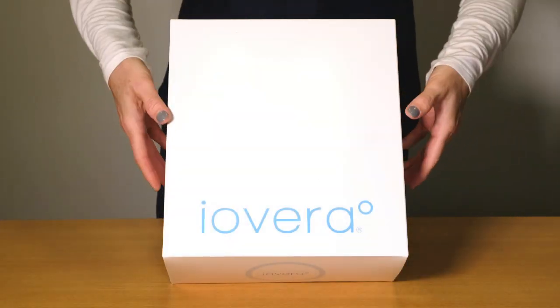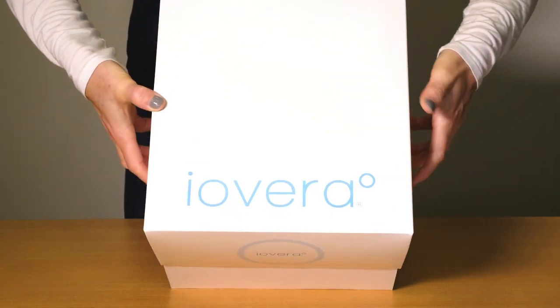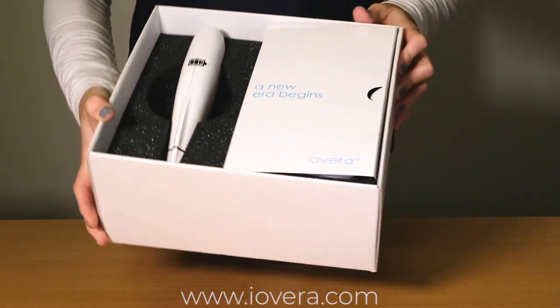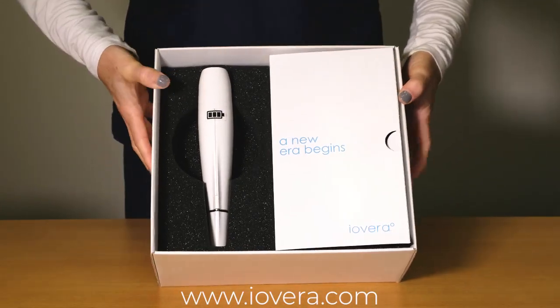Welcome to the iOVERA System Setup Video. For detailed instructions, the user guide can be found at iovera.com.